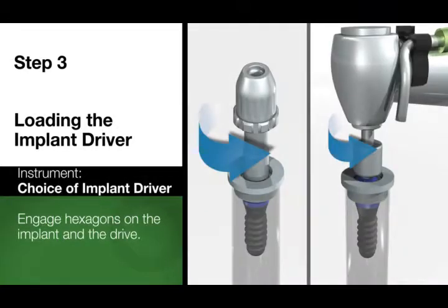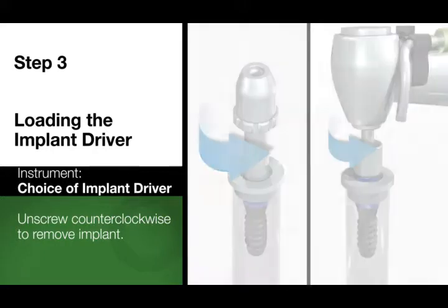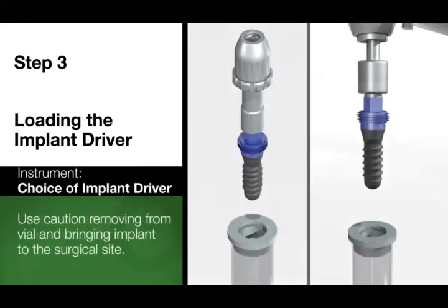Step 3. Loading the implant driver. Engage the driver with the top transfer of the OCTAGON implant extending out of the top of the implant suspension chamber. With simple counterclockwise motion, unscrew to remove the implant. Use caution when removing the implant and moving to the surgical site.